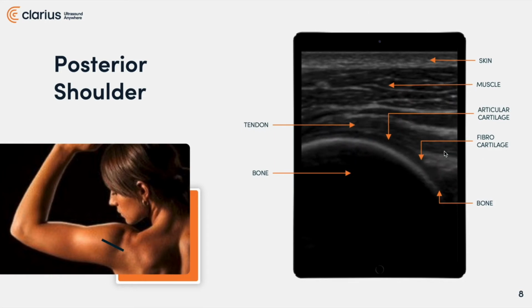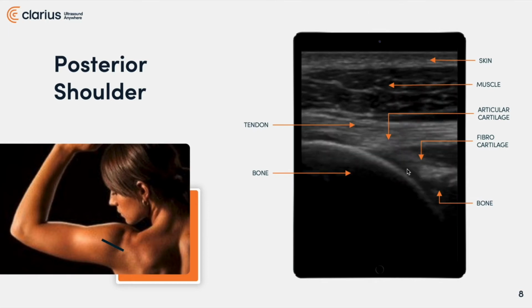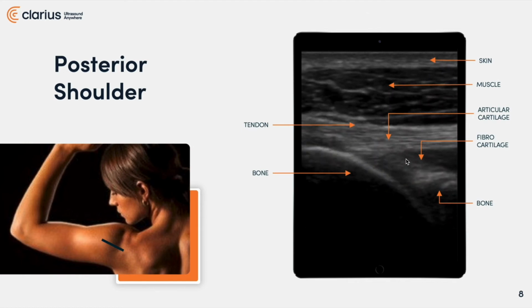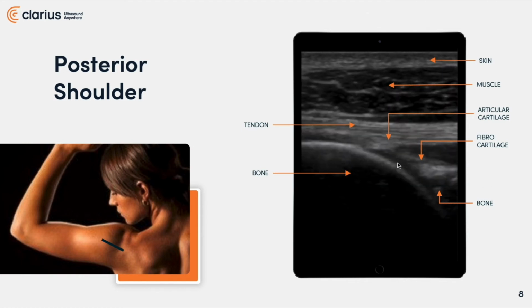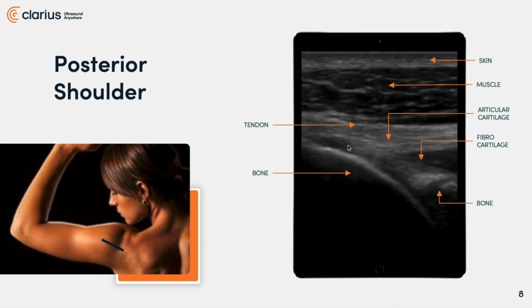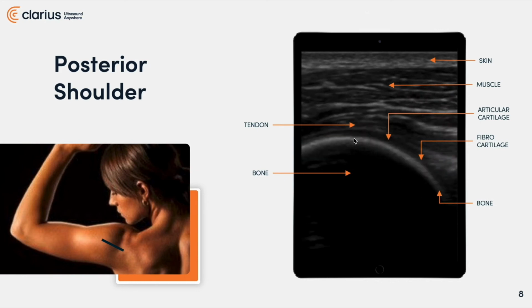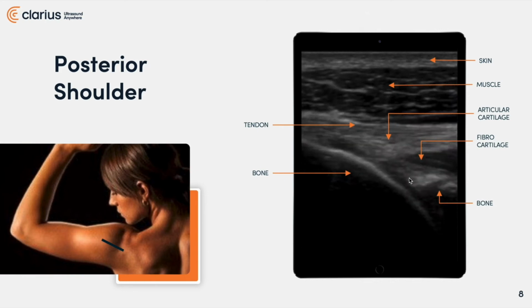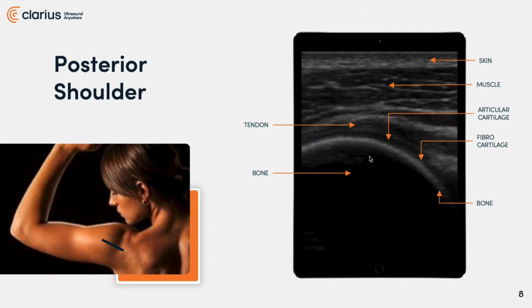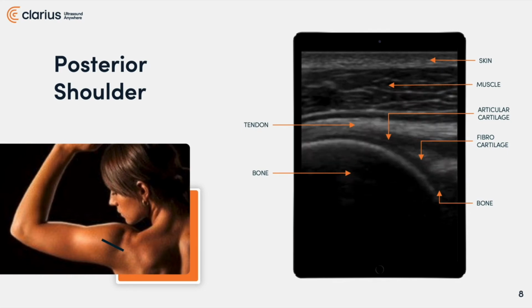And if you look close, you'll see that the labrum itself is altering its shape to correspond to the surface of the humeral head. And finally, looking at the picture, this dark region I'm pointing to right here, and you'll see it come up here, that's articular cartilage. We're actually able to see and dimension whether a patient has articular cartilage in varying views.